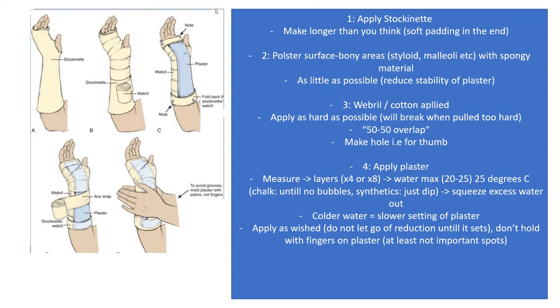Then you put it into water when you know how much you need. The colder the water is, the slower the process is, and it can maximally be 25 degrees. With the chalk, you put it into water until there are no bubbles left. With the synthetic, you just dip it, and then it'll be all right. Squeeze excess water out, and then you can use colder water if you want it to set slower. These are the nuances. And then apply as wished.